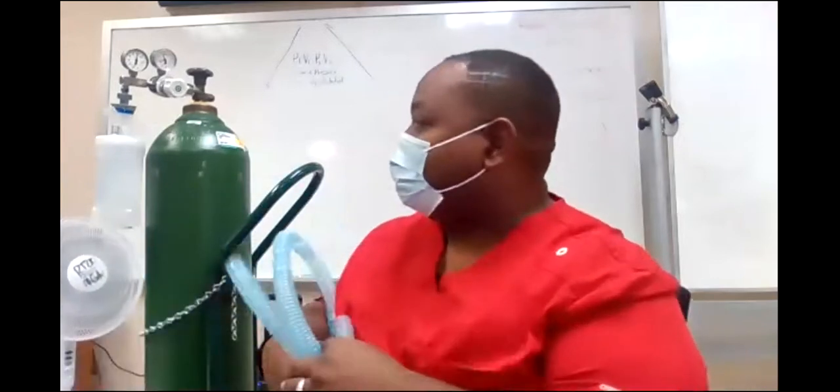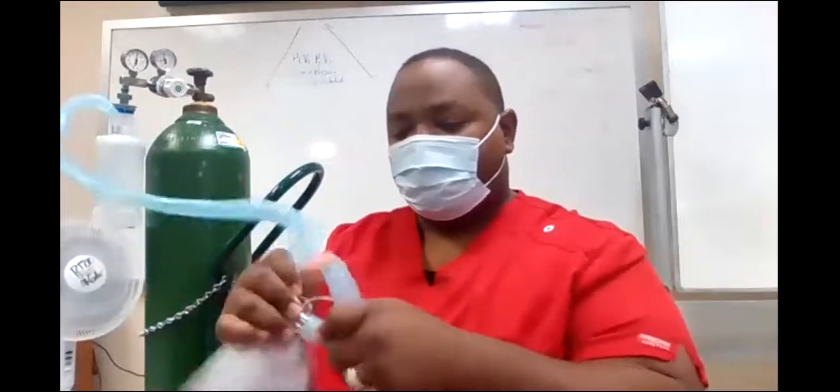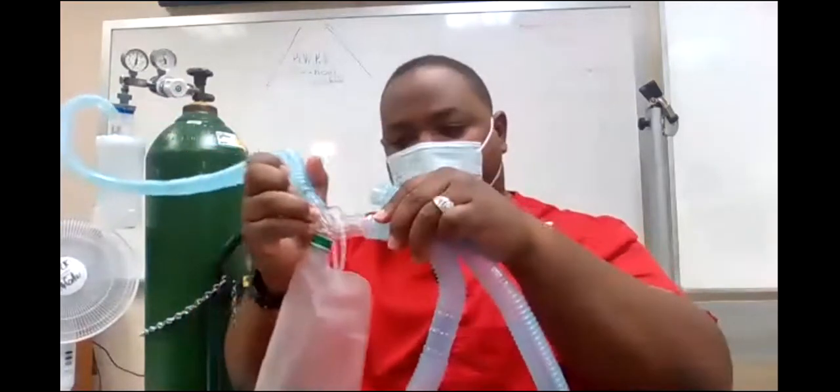All right, so Ms. Rose, what do I have first? Large volume nebulizer, also known as an LVN. LVN, then you have what goes here. Large, say large bore, because large bore and small bore mean a lot, okay? The corrugated tubing is large bore tubing. So one large bore tubing goes here. All right, then what goes after that first large bore tubing? Your water bag, right? And then what goes after the water bag? Another large bore tubing, and then what goes here? Whatever you want to put on.